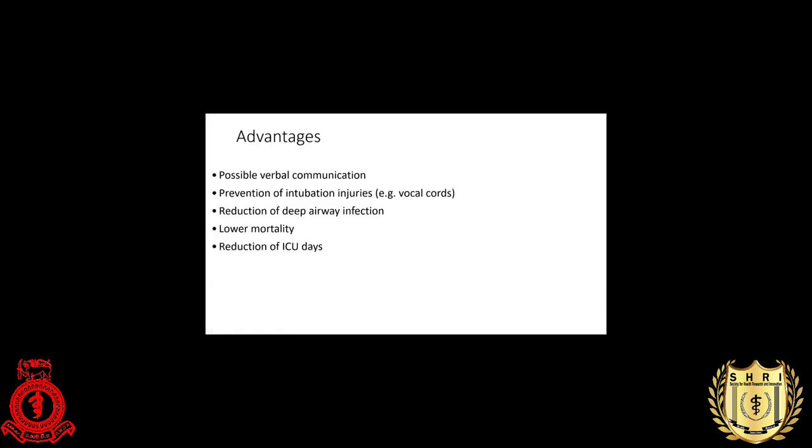These are the advantages of non-invasive ventilation in general. It reduces the mortality, reduces the ICU days, and also reduces deep airway infection like ventilator-associated pneumonia occurring in ventilated patients, and also prevents intubation injuries. And possibly, if you put on a nasal mask, the patient can communicate.